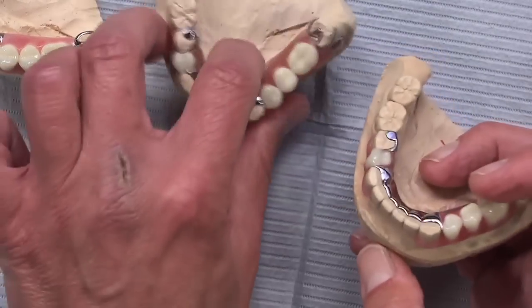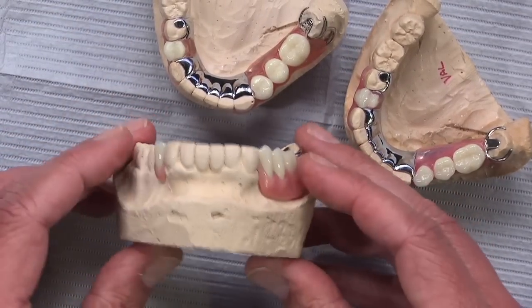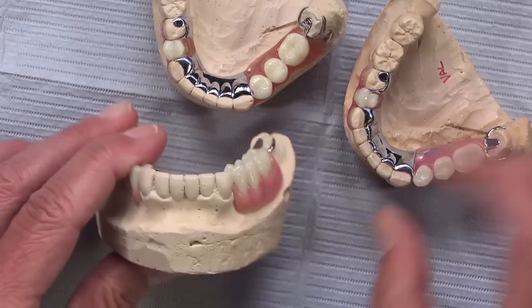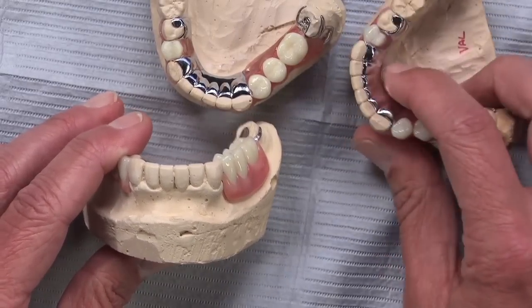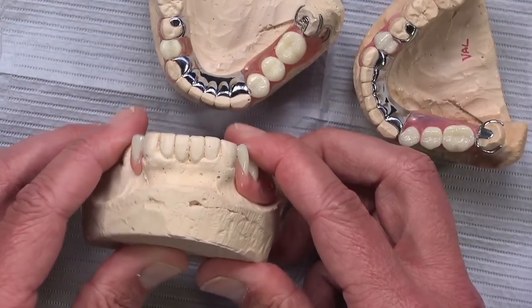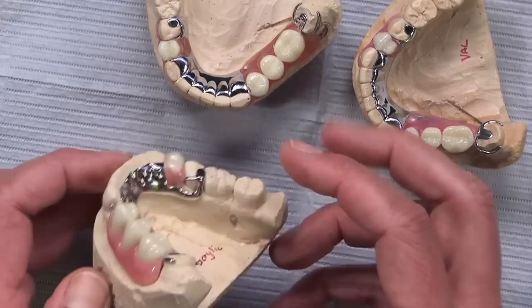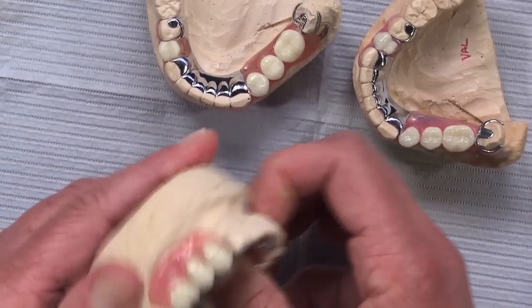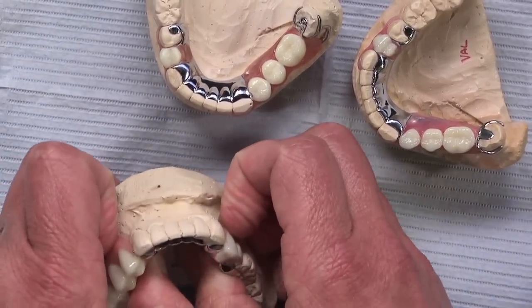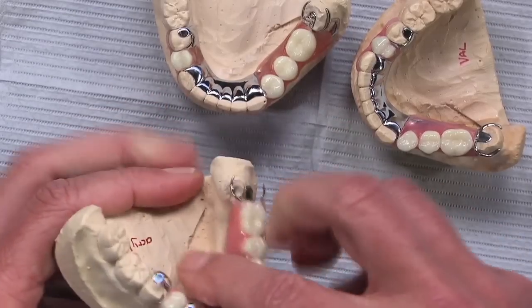Now, for example, if we look at this acrylic partial, since we have acrylic here, we can't make the clasps out of acrylic like we were able to do on the Valplast and the Duraflex, where it's okay to carry that clasp around there. And so on something like this, we've had to go and hide the clasps. And the way we do this aesthetic clasp is by actually engaging the undercut on the distal side of these cuspids. If I can get this little guy off of here.